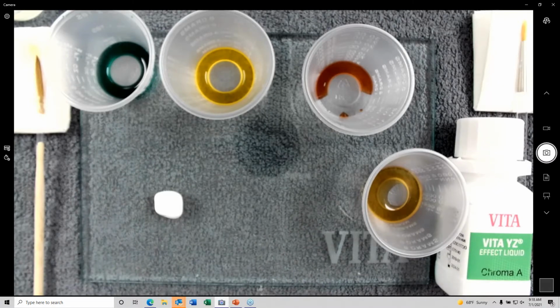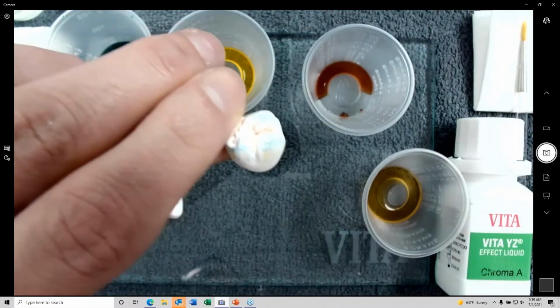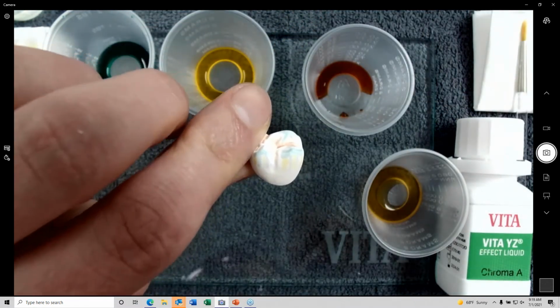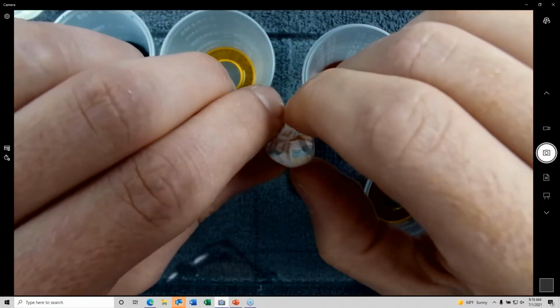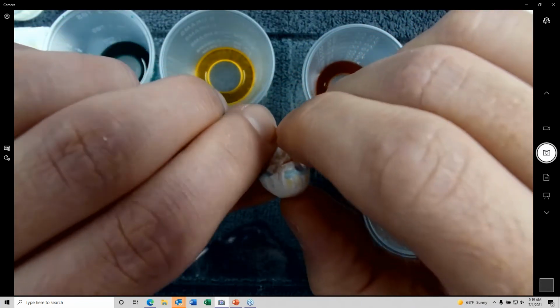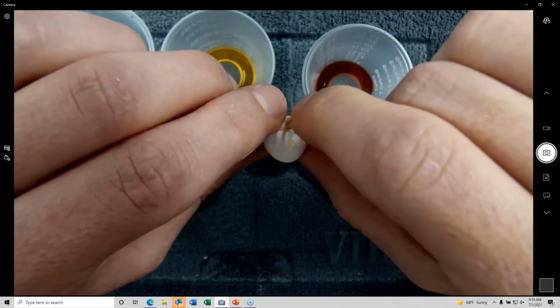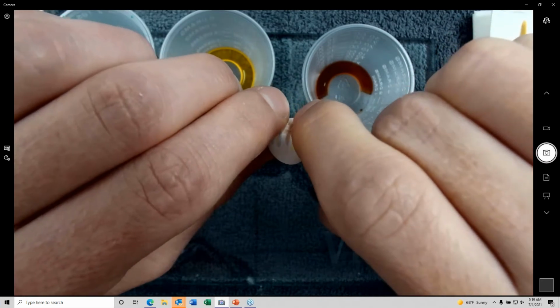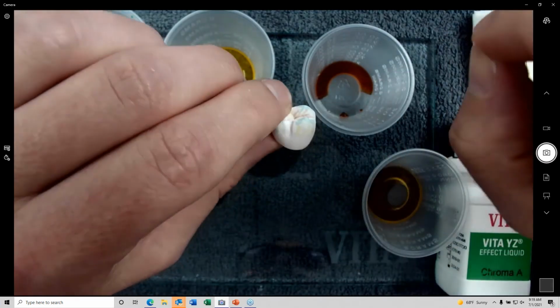goodness, to be perfectly honest, I don't do enough production cases to know, because when I'm doing these, I will stain them and then either leave them overnight and fire them in the morning, or something like that, because I don't actually have a heat lamp here. So I will try and find that out for you. Send me an email and I'll try and get you a better answer, okay?